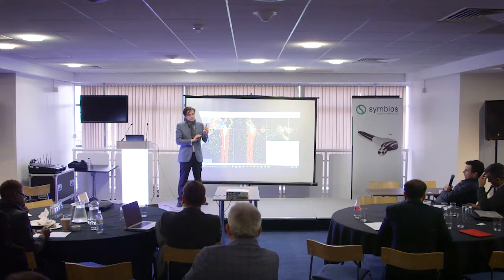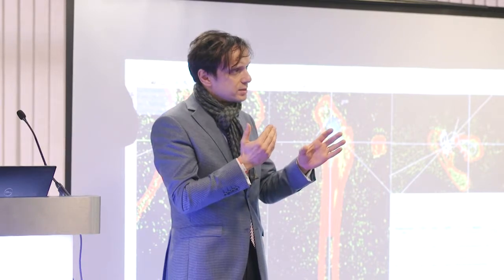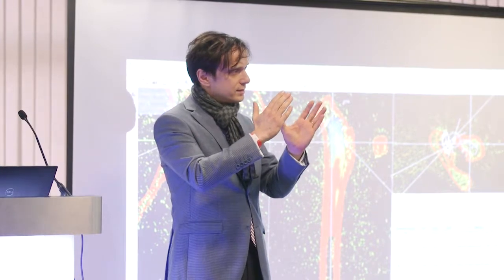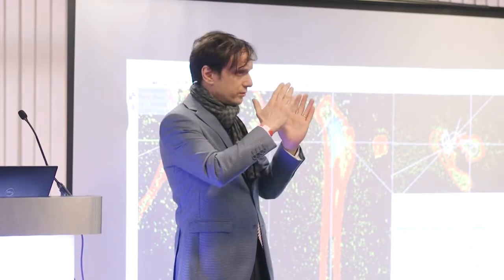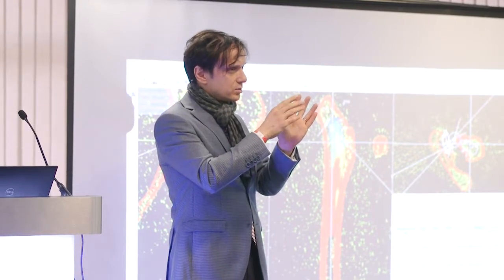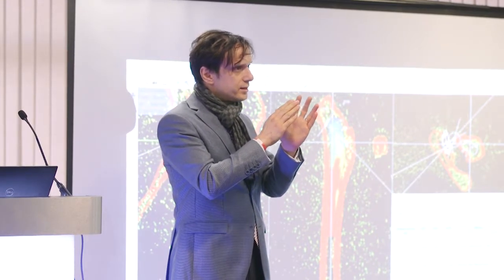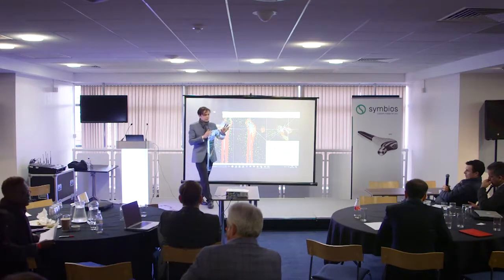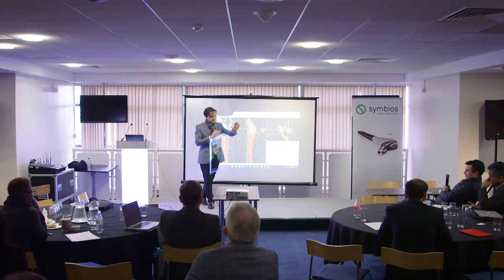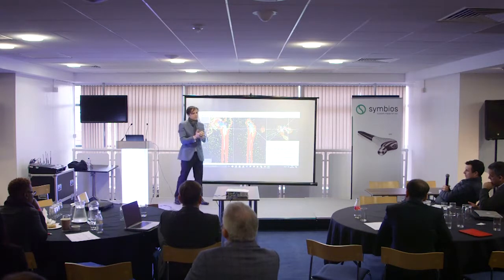The problem also is that there are some kind of industrial constraints. We cannot design anything. It has to resist the fatigue tests. So this is why they are limited in their range of design. I would like to see these cases, but to increase the femoral offset on the valgus, we really need either a very, very strong valgus. It means sometimes, I don't know, 15 millimeters femoral offset. These candle femurs, quite rare, but maybe.